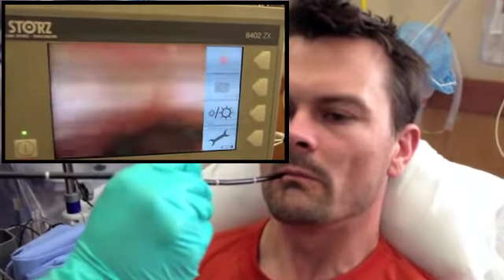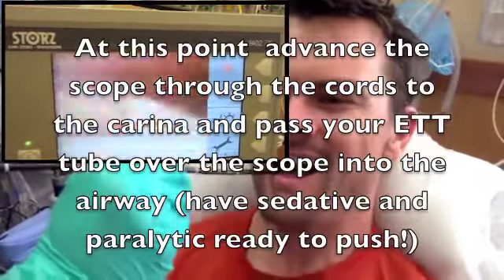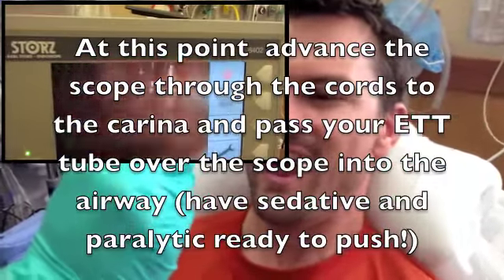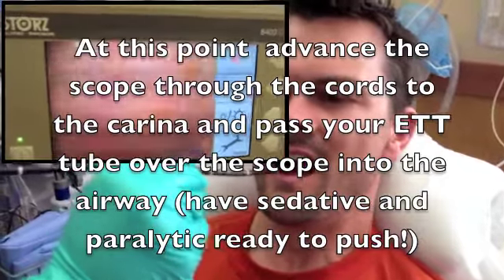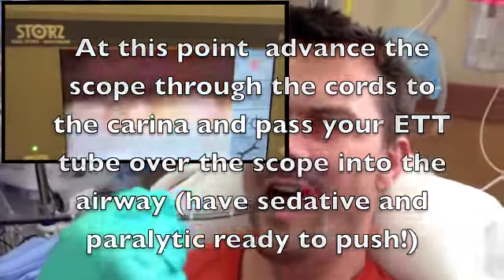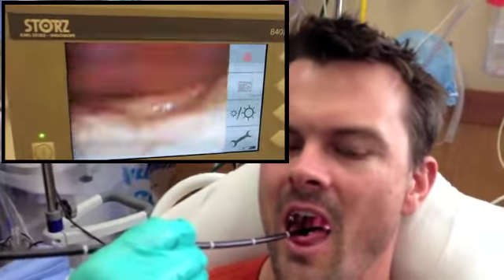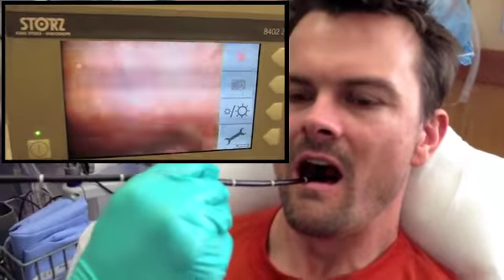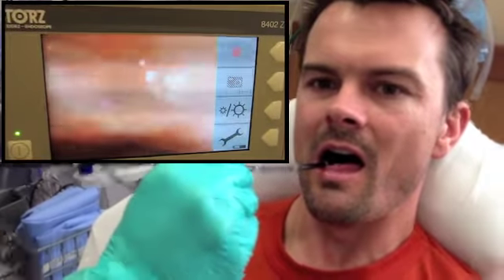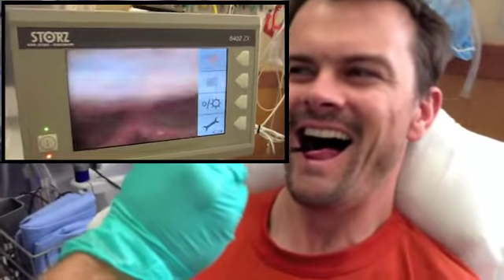Swallow, Clay. Sorry. If you can. Okay. There's the epiglottis. Looks normal. You put it just right here.